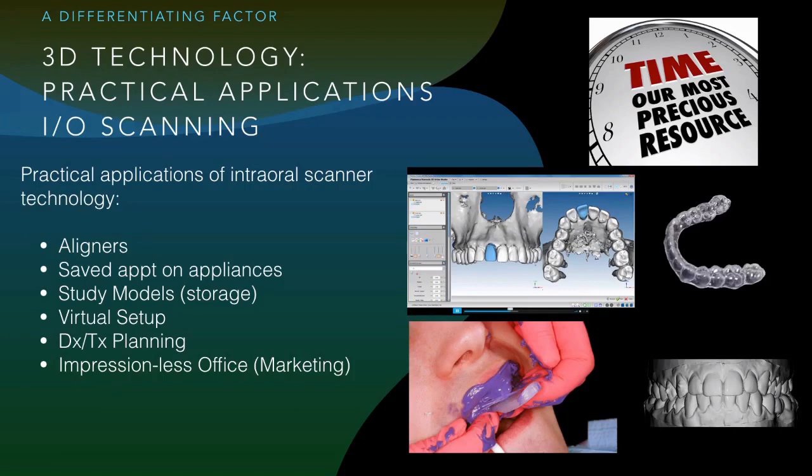Other benefits of using intraoral scanning would be saved appointments on appliances, ability to have study models and digital storage of those, doing a virtual setup so you can virtually walk through the case prior to treating the case in the office, diagnostic and treatment planning options, and you being able to show those to the patient all starts with that intraoral scan. And then ultimately, and this is a big marketing, I call it a gimmick. I don't know how beneficial it is. I think a lot of orthodontists, at least where I practice, seem to have intraoral scanners in their practices, but you can market being an impressionless office.